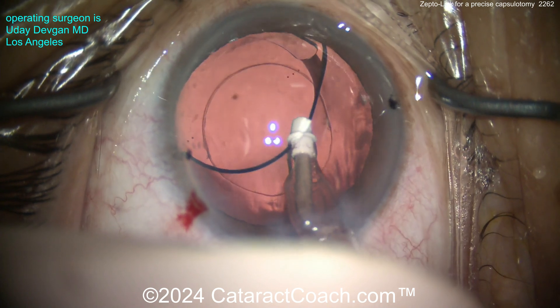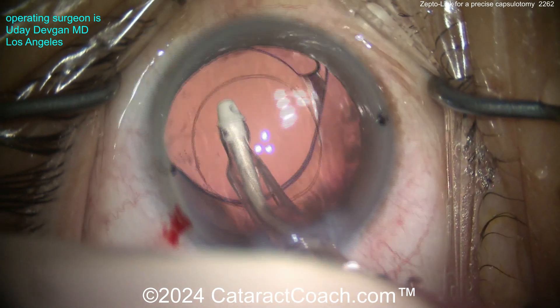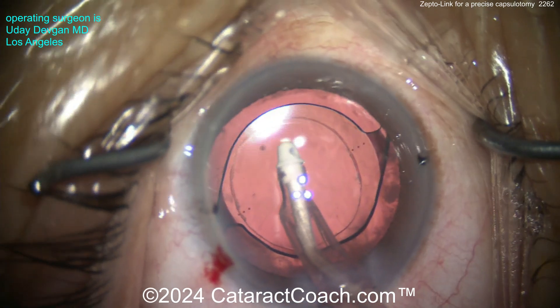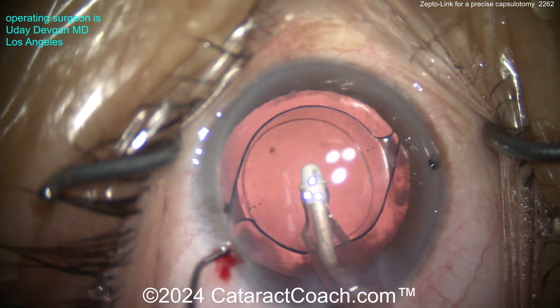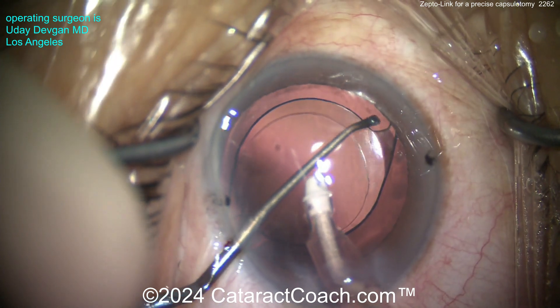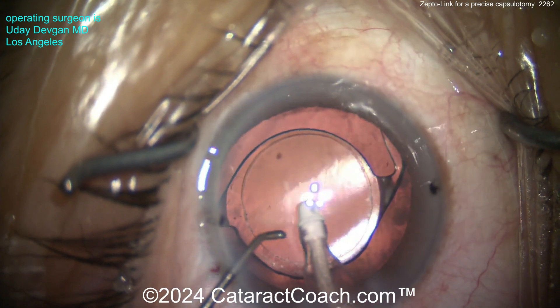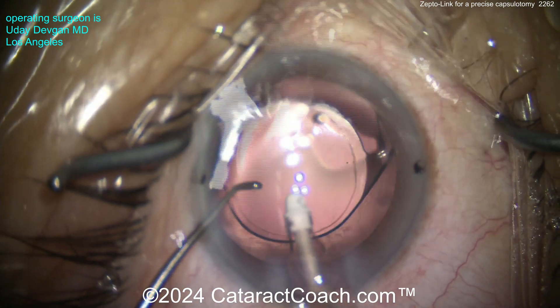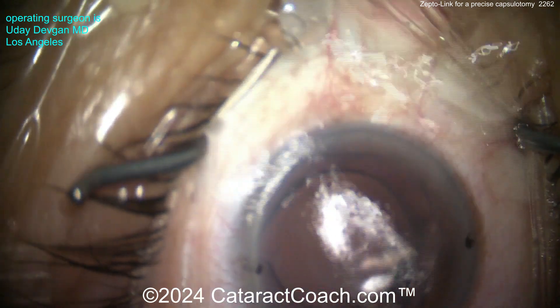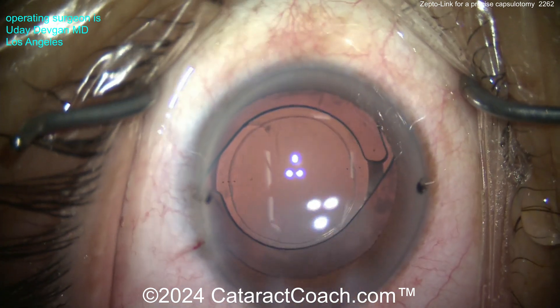Let's remove the viscoelastic. What I'm most happy about is that it's a very strong capsulotomy — it's going to keep the lens beautifully centered. I can place it wherever I want, so even in a tough case like a traumatic cataract with a decentered nucleus, I can still place the capsulotomy wherever I feel is best. Lining up that toric lens — look at that overlap, just about perfect.